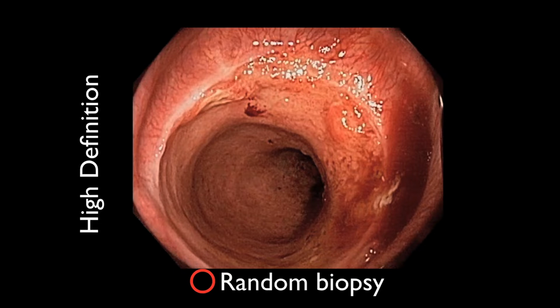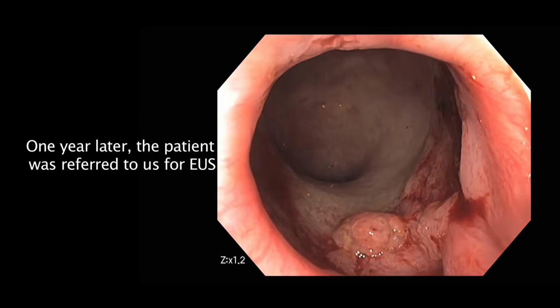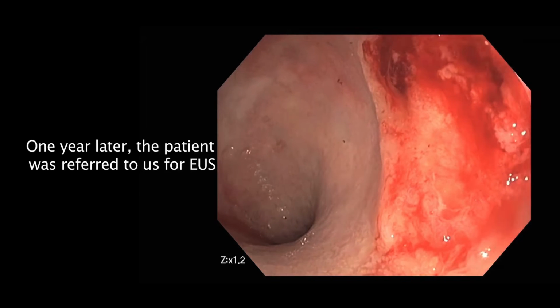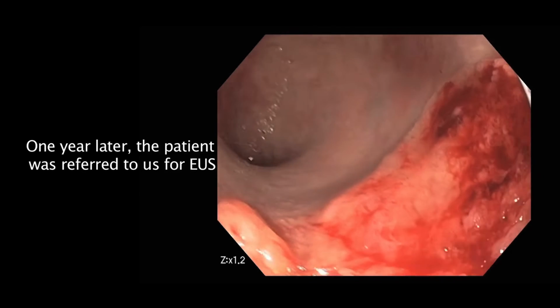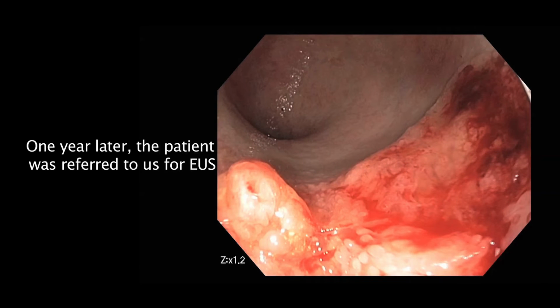In patients with IBD, random colon biopsy is the standard practice to detect and diagnose dysplasia. Here, we outline the random biopsies taken of this area, as seen by the blood, that unfortunately miss this unrecognized depressed lesion. At routine surveillance 1 year later, a large, depressed mass was identified at the same location. After biopsy and EUS staging, a T2 poorly differentiated cancer was confirmed. Clearly, random biopsies have their limitations.